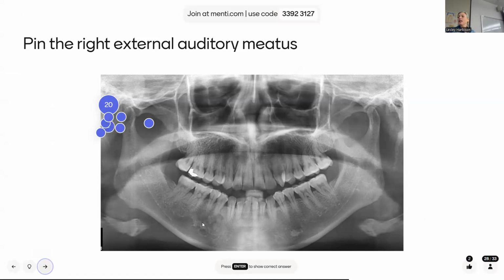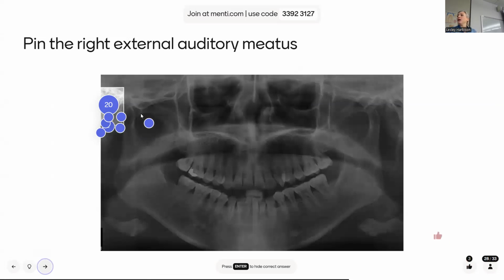Did any of you see that? We got something going on there. Something weird. Don't know what it is. Not normal. Good. Yes. So up here, you can see it over here. That's the external auditory meatus, the little black circle. Then you can see soft tissue around here. Sometimes I think that's the styloid process, although I was trying to look for a panel with a good styloid process, and that's not great, but I think that's what that is.